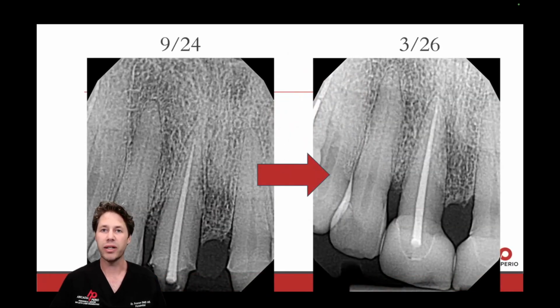Let's highlight this periodontal defect on this radiograph dated 9/24. Look at the circumferential type defect extending from the distal aspect of tooth number 9, wrapping around to the palatal aspect with localized periodontal defects, roughly in the ballpark of 8 to 9 millimeters.